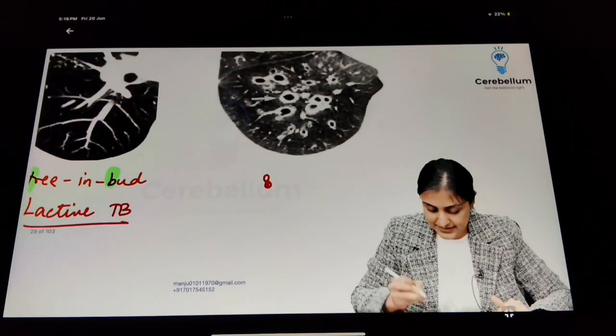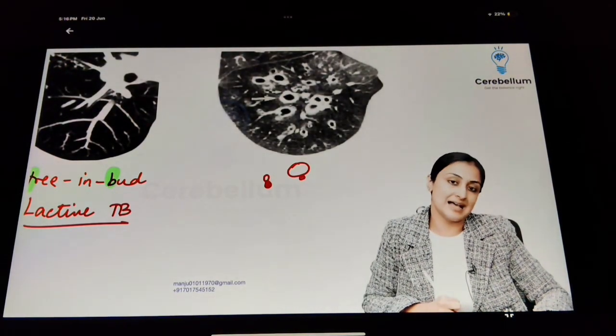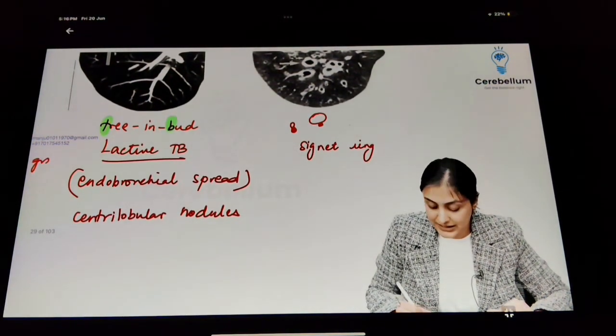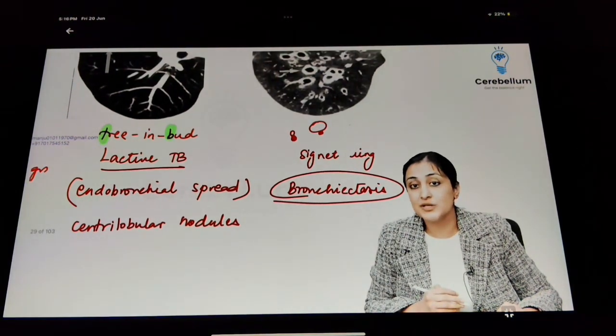Yeah, both of them have the same size. But when there is bronchiectasis, now the air-filled bronchus will enlarge, artery remains as it is. So this is what gives rise to the signet ring appearance, and that indicates that the bronchial tree is dilated, called bronchiectasis. So bronchiectasis, remember, is the irreversible dilatation of the bronchi.